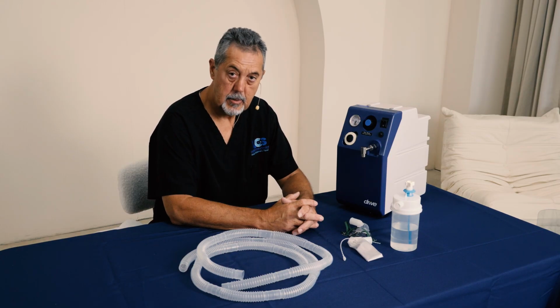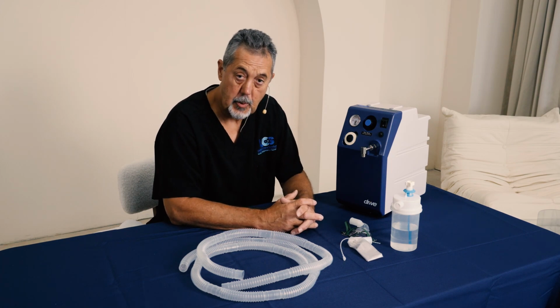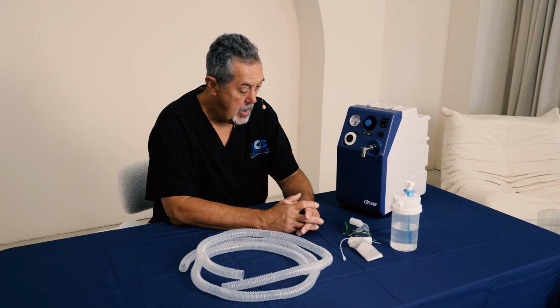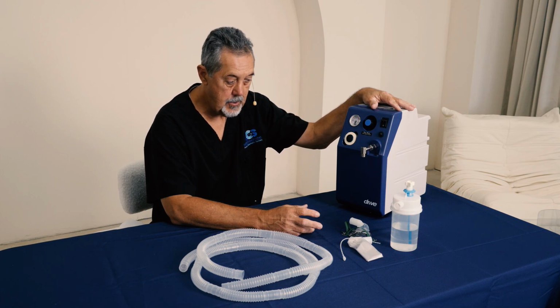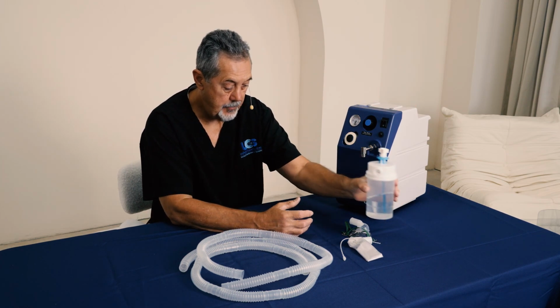Hello, we're going to be talking about a cool mist aerosol. The purpose of a cool mist aerosol is to provide humidity for a tracheostomy patient. In order to do this, we're going to use what's called a 50 psi compressor. We're going to use a large volume nebulizer.